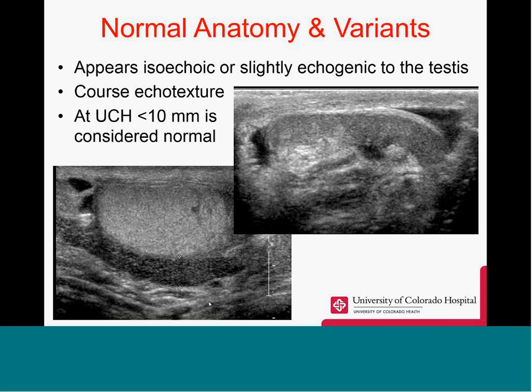Here on ultrasound, the epididymis appears isoechoic or slightly echogenic to the testicle. It does have a coarse echo texture. And here at the University of Colorado, any measurement less than 10 millimeters in an AP dimension is considered normal.